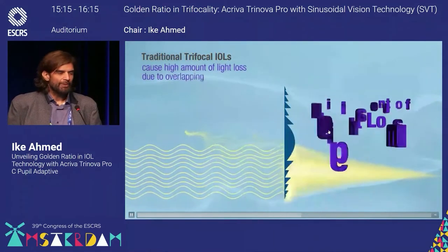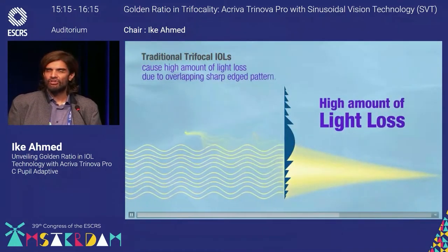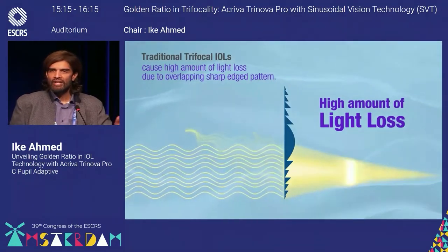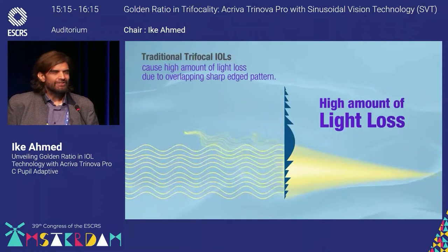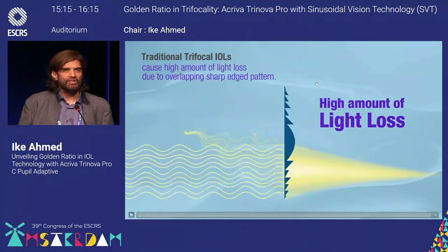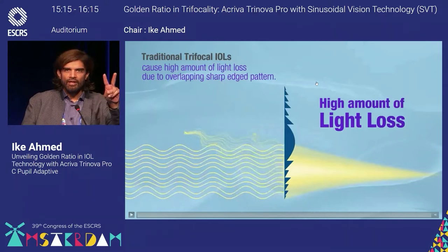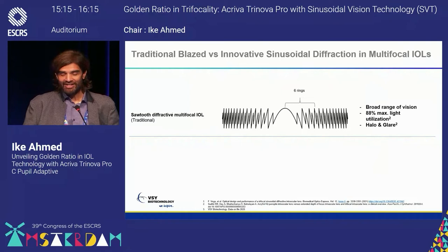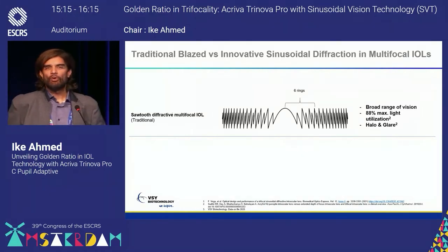The problem with these sharp edges and the typical blaze or sawtooth is we have some loss of light with the second order wavefront. What does this do? It means there's less lens light transmission that occurs in this lens and dysphotopsia. Two issues that make us concerned about multifocality. Next slide. Okay. So here's an example, a more focused example on traditional sawtooth diffractive multifocal.